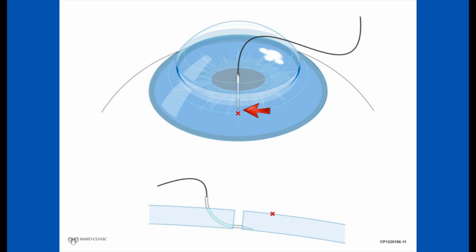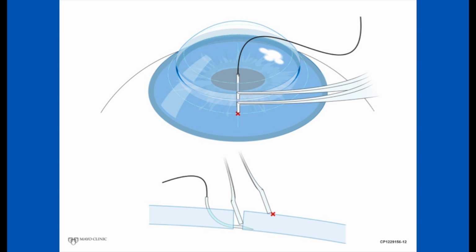Why don't we just drive through? Because the host has to be stabilized with the forceps before the drive to make sure the host doesn't wobble and lead to a non-deep and/or non-radial needle passage. We stabilize the host with the two tips of the forceps. The maneuver is the same as we used earlier on the graft side. One tip engages deep down the wound edge, and the other engages at a 45-degree angle along the intended radius of passage.